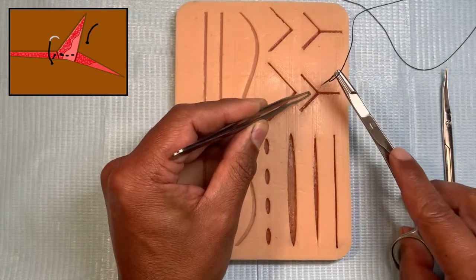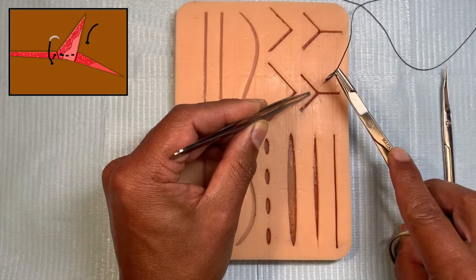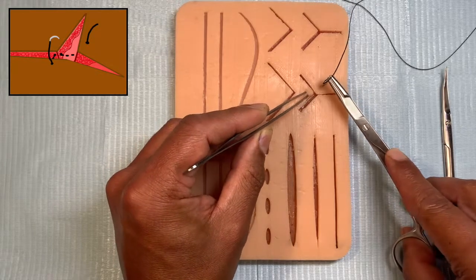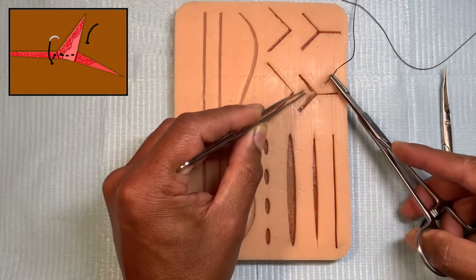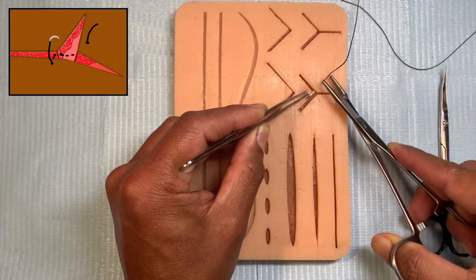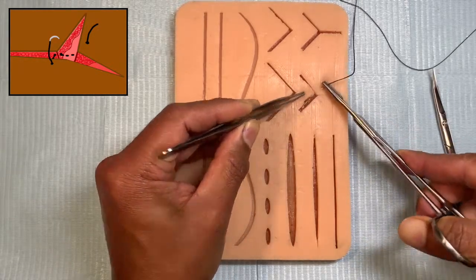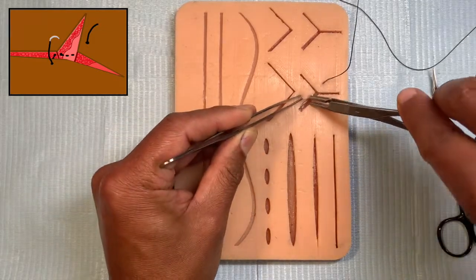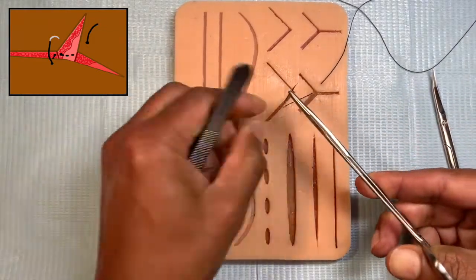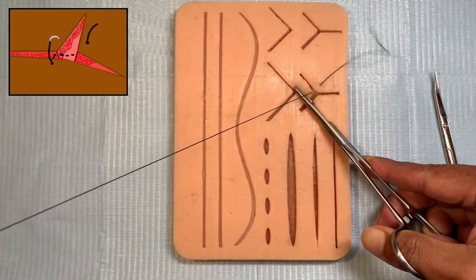So again proper hold of the instrument and then you pass the suture through the skin, bringing it perpendicular to the skin surface. Very important to hold properly and not hold the swedge or the tip of the needle. So you pick the needle out.